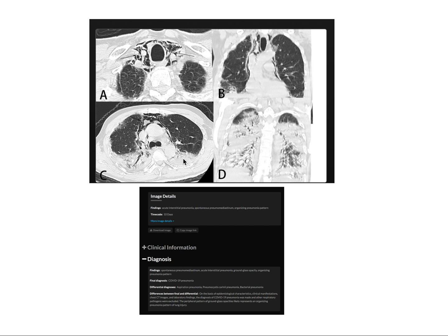This is one of the recent complications which was discovered and published in RSNA. It is a known case of coronavirus showing extensive consolidation, predominantly peripheral with basal segmental involvement, and the presence of pneumomediastinum was the complication stated in this proven case of coronavirus infection.